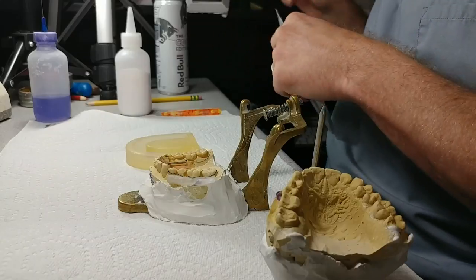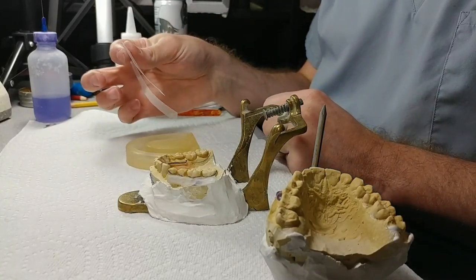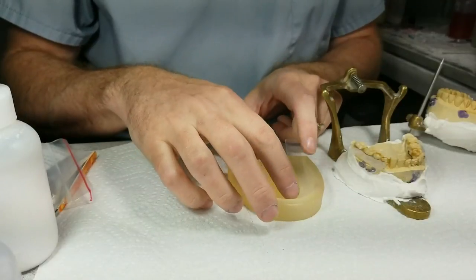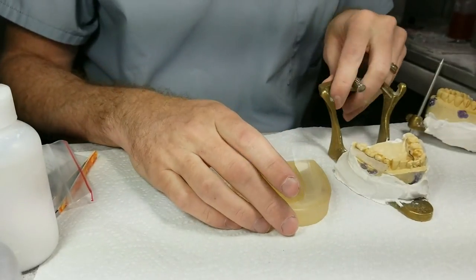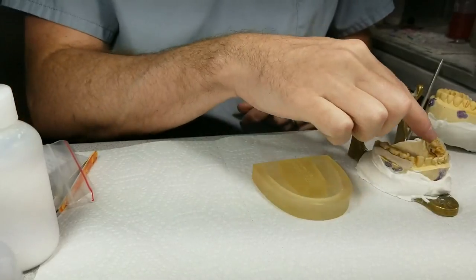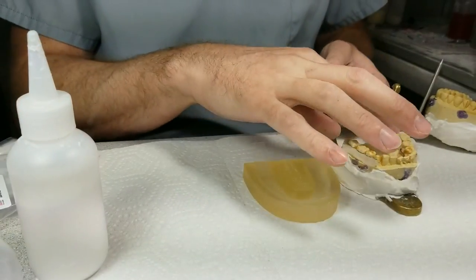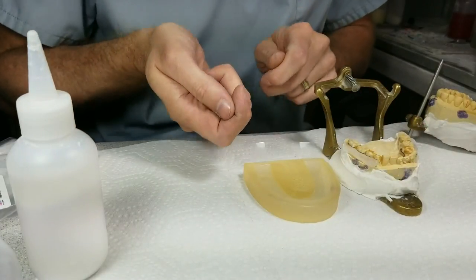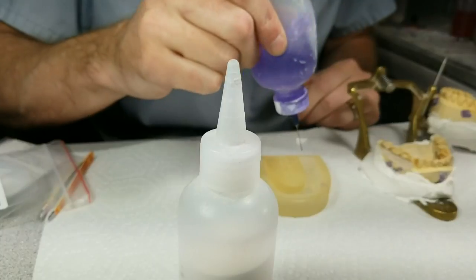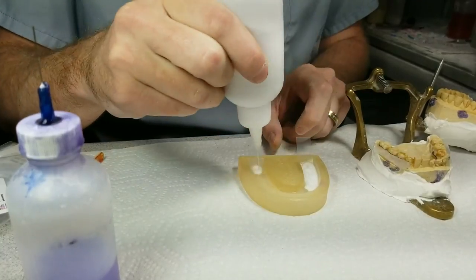The packet comes with these Easy Form Liners — a certain type of plastic — and you lay it inside of here. I'm going to fill up the posteriors. I don't need the anterior, I'm going to do that by hand. I'll fill up the posterior sections and let it set up, and while it's setting up I'm going to add acrylic around the bar, then flip it over onto the model and mold it into place.